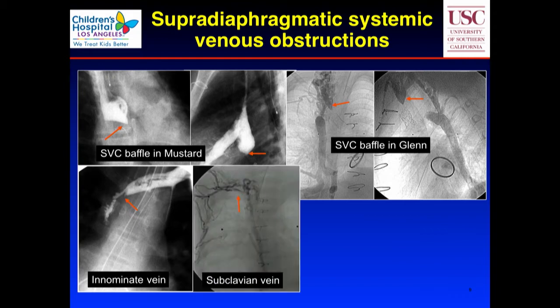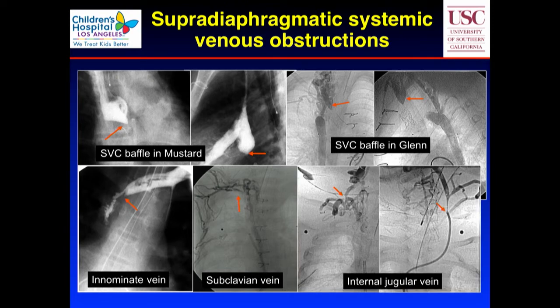This patient actually has subclavian veins, again, we use these for PICC lines, right? Subclavian veins gone in this patient. This patient actually has internal jugular veins that are gone. Again, red arrows point to you where the obstructions are. See all those little wormy-looking vessels? That's the body trying to make its way, get the blood back in. Of course, it's not as efficient as a major highway, but the body's trying to get the blood in. It's just not adequate. So the head will just swell up. This is what we call SVC syndrome.